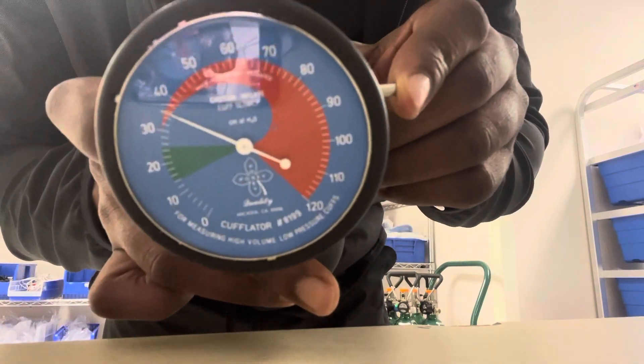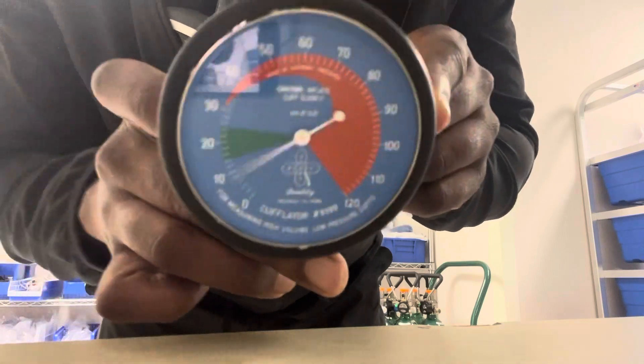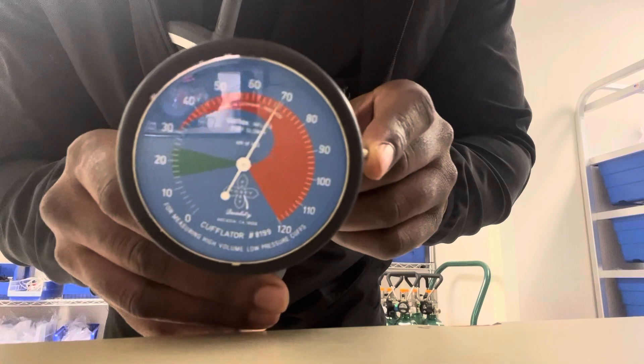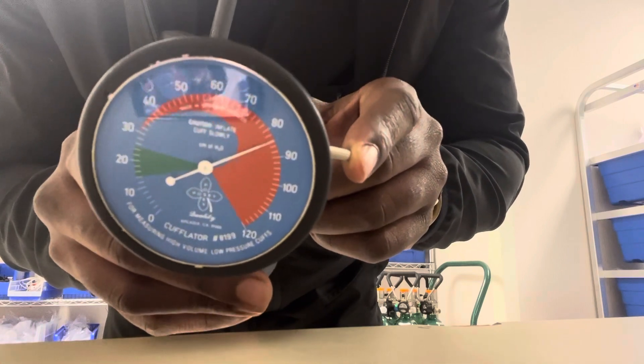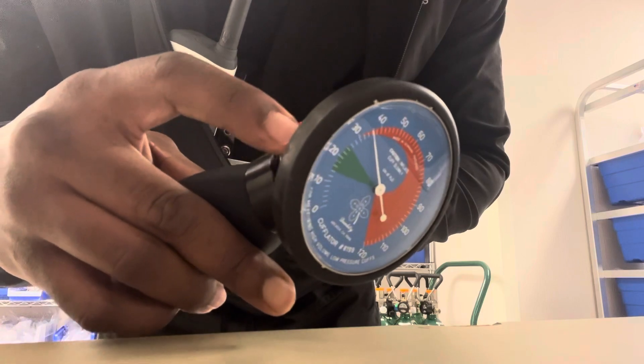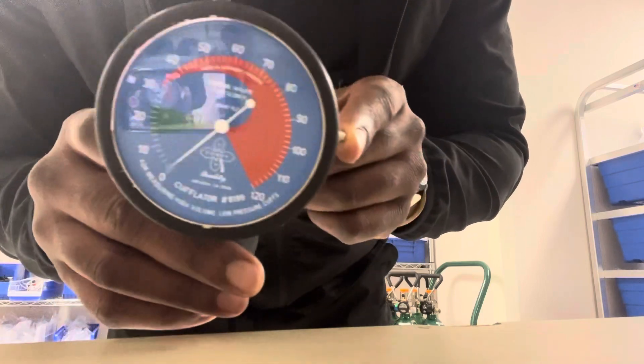This button on the side — this red button — allows us to relieve pressure from the cuff. So if you over-inflate the cuff, which is too high, you push this red button and it'll help us relieve some of the pressure from the cuff.